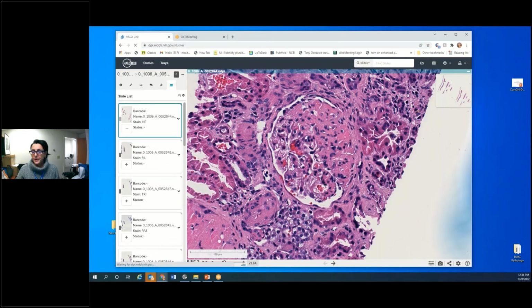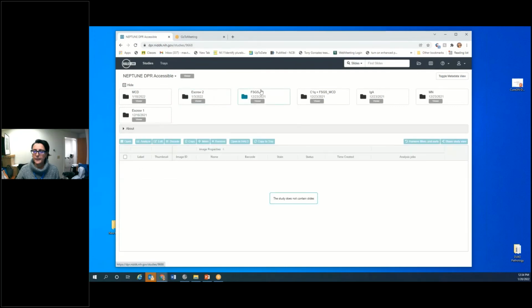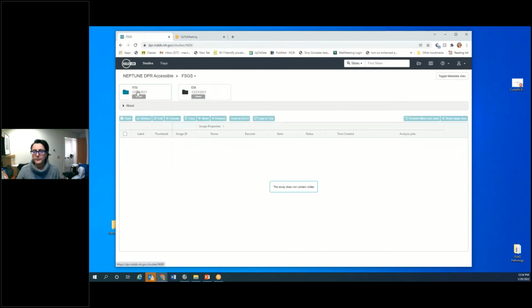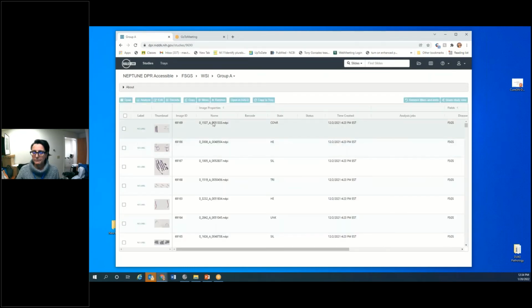So this is from a tray. You can open an image from the main folder, obviously.